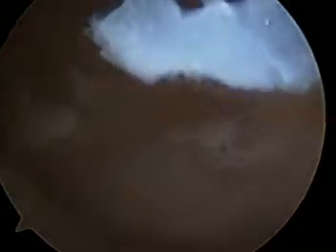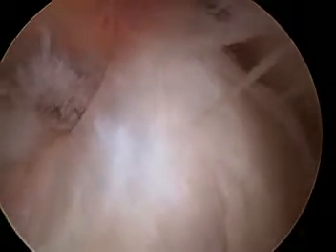Okay, now I'm going to slip on back behind the knee and look posteriorly and medially. Okay, we're back behind the knee and we see some loose debris floating around there. I'm going to use my cannula technique to remove that. Okay, so those chunks of articular cartilage are gone. Rotating the scope centrally and withdrawing, we see the posterior and then the anterior cruciate ligaments.